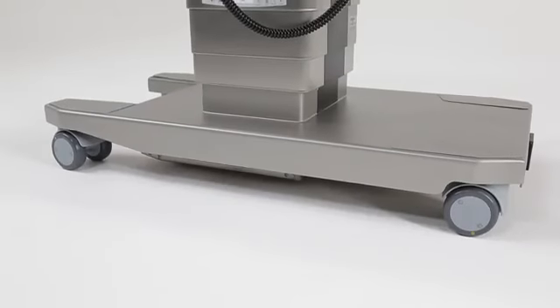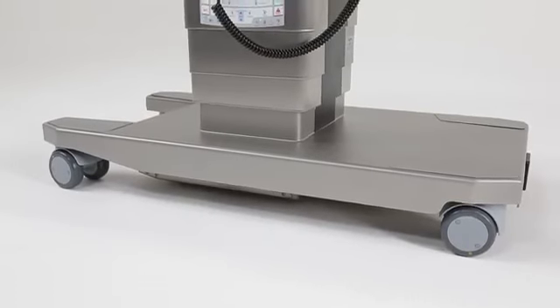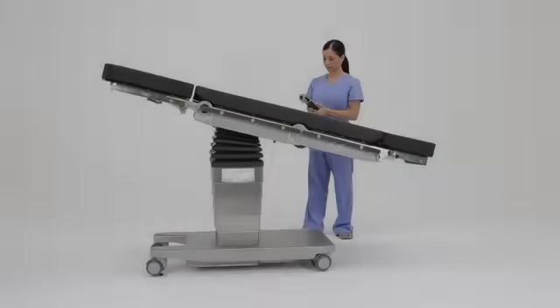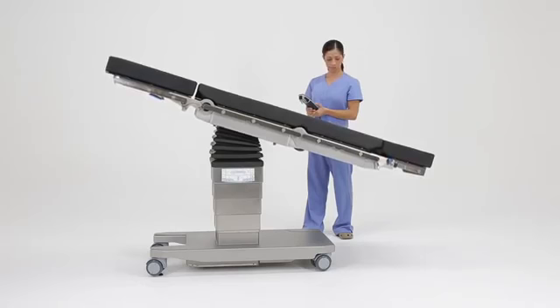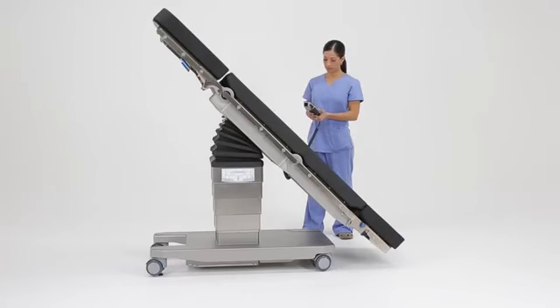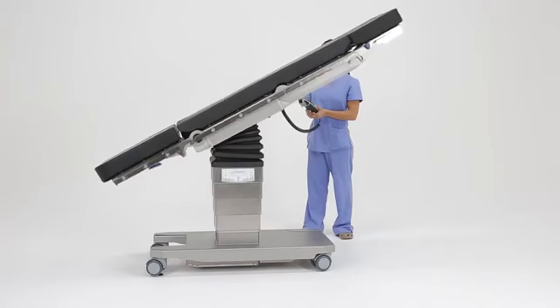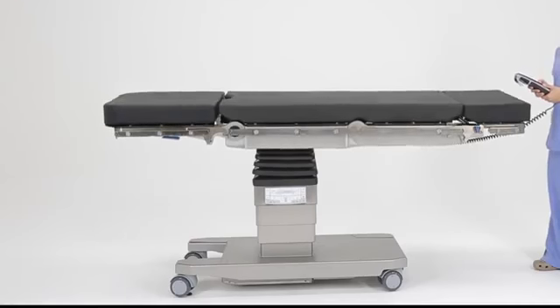Rising out of the strong foundation of the TS-7000 base is the column, the muscle and brains of the table. With the TruSystem 7000, Trumpf continues our tradition of using electromechanical motors, not complicated hydraulic systems. This gives us exceptional reliability, but also enables many intelligent features.